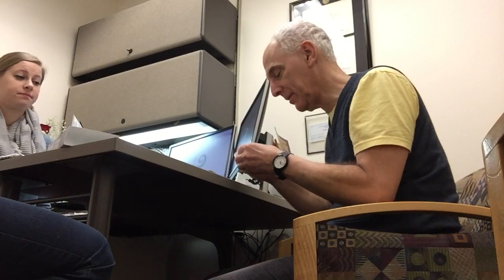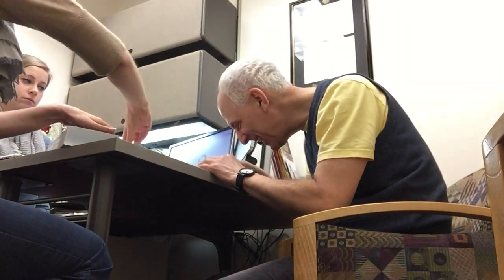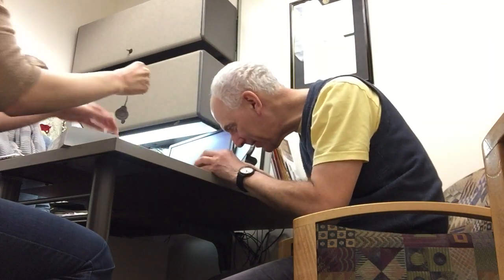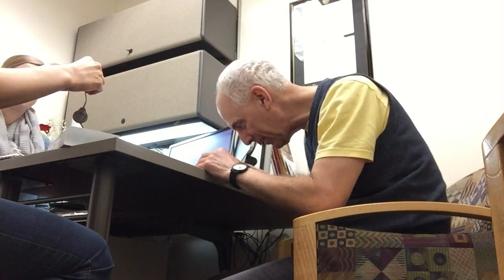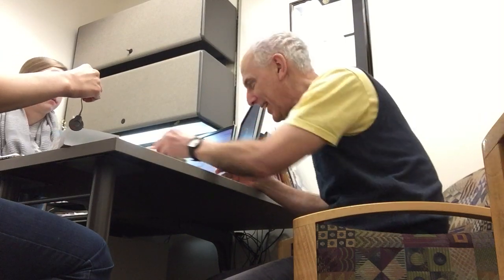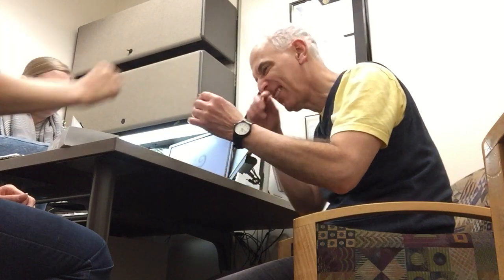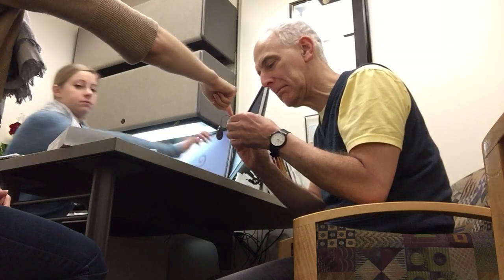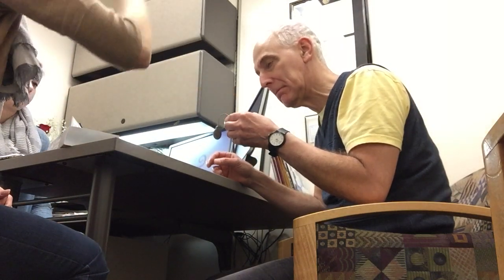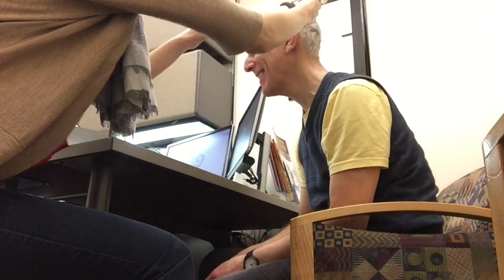These have been great for what they do. Do you want to just rest it on your ear then? Yeah. Let's see if I can get these curly cues in there. Do you want me to close that for you? Yeah, I'm getting all confused. I'll work on this. You want to just put that on your ear, see how it feels? Which way am I going? That is going to go behind the ear, and the ear hook, that clear part, in front. So like this. You want me to do it? Yeah. Okay, I'm confused. Oh, I see.